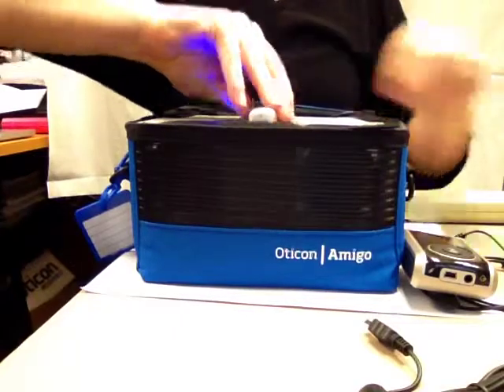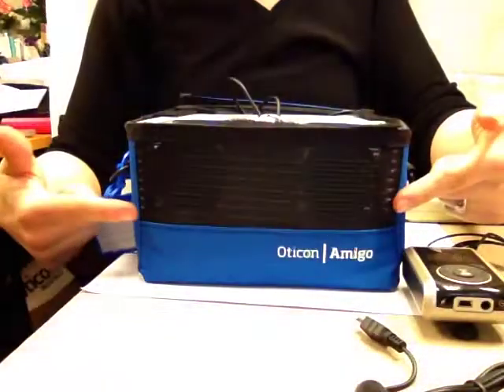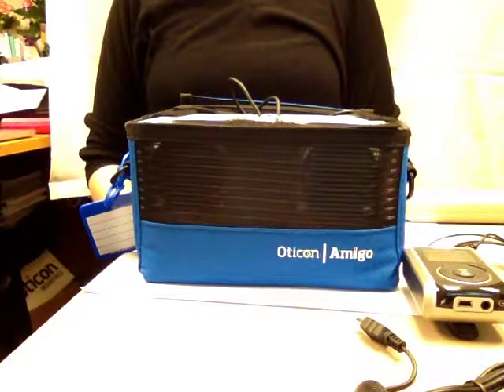Speak into the Oticon T20 transmitter's microphone. You should hear yourself through the Amigo Desktop speaker. If you do, that's great. That means the system is working. If you can't hear yourself, try the following.